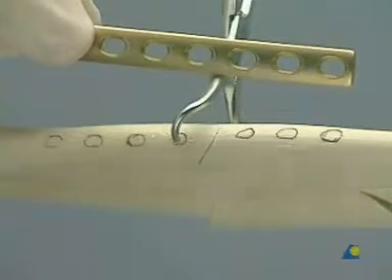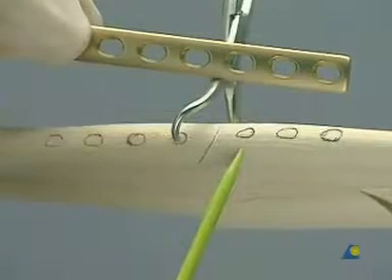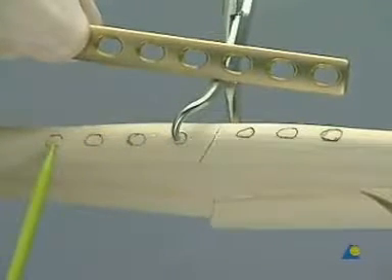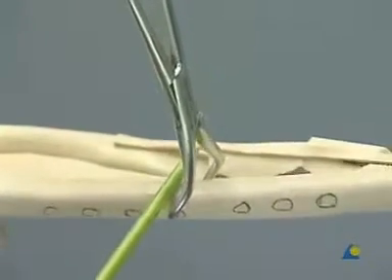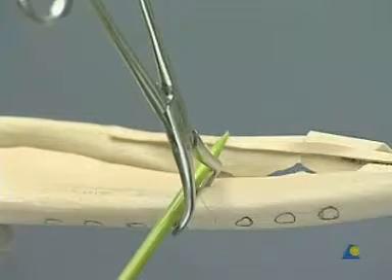It is useful to mark the screw hole sites once the plate has been contoured to match the template. The reduction forceps has been placed in the optimum line for the lag screw. The screw will be inserted through the plate once it has been sighted at its pre-planned position.